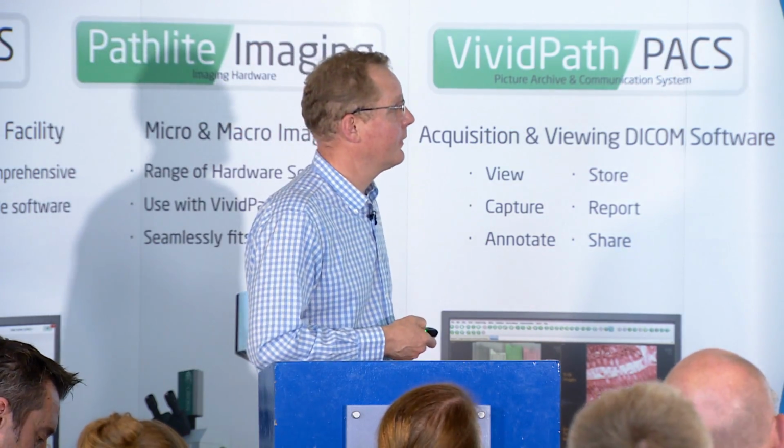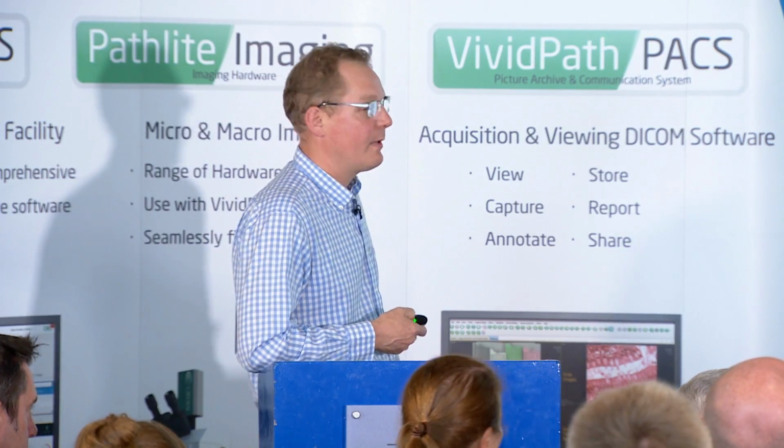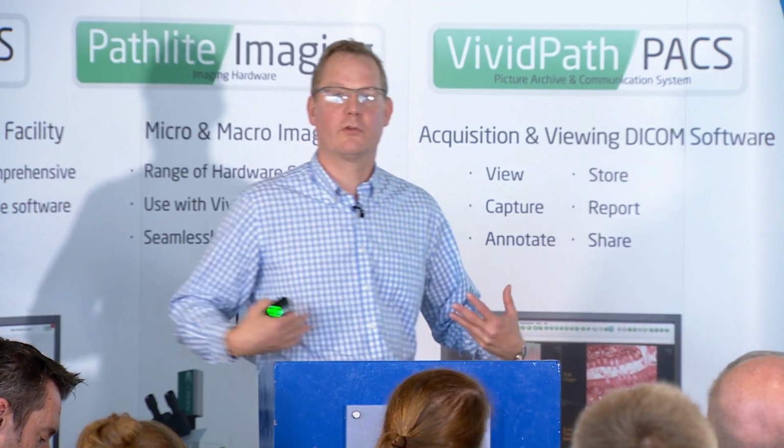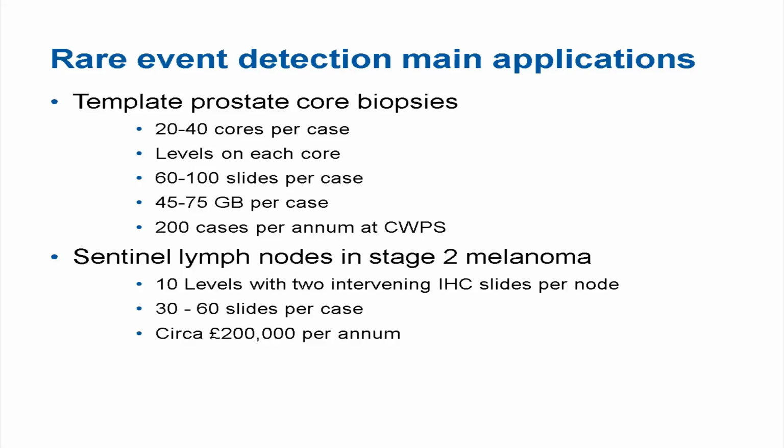So this is a lot of data, and this is where you want your upstream algorithm running. You want to export all of these images onto a server, and you want a server to be grinding through them and finding the cancer, which it can then present to pathologists for verification and sign out. And that will alleviate a lot of the tedium and the boredom at this level.